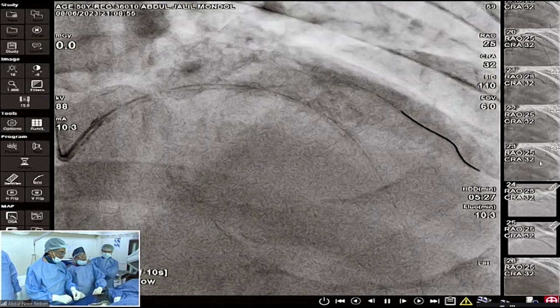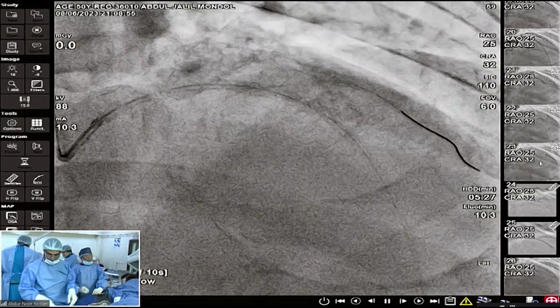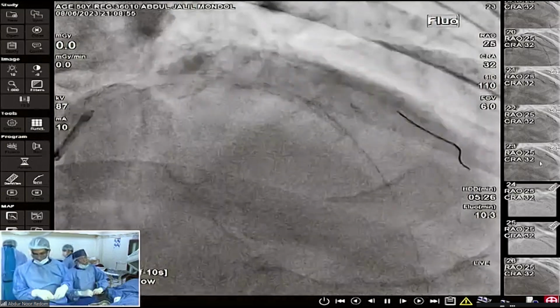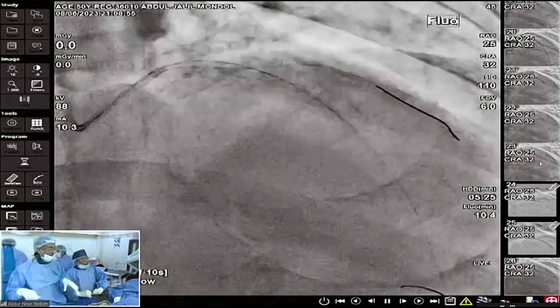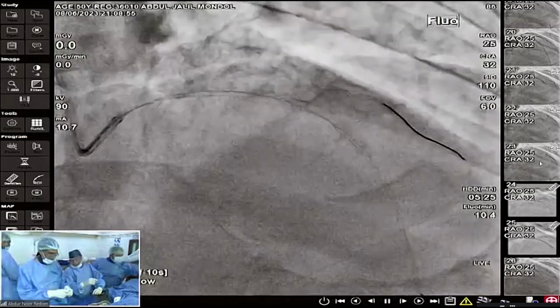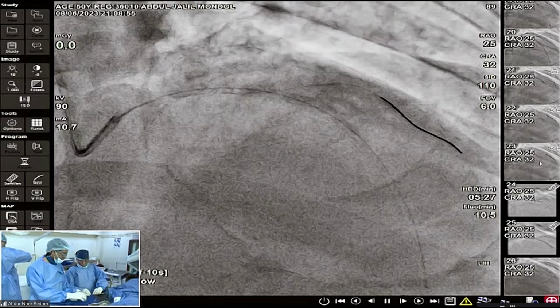You see, we have post dilated while keeping the side branch wire as it is. Many a time we keep the side branch wire up to the complete post dilatation. In that case, what is my practice, I stop the noradrenaline, please. And the pressure is all right.